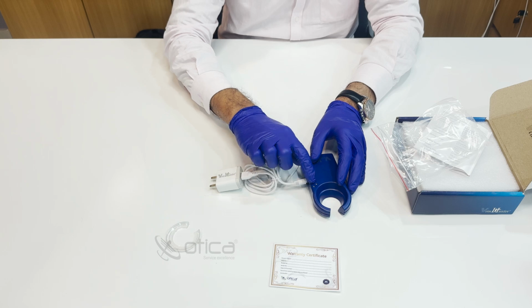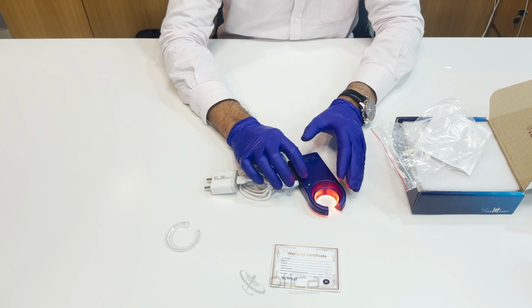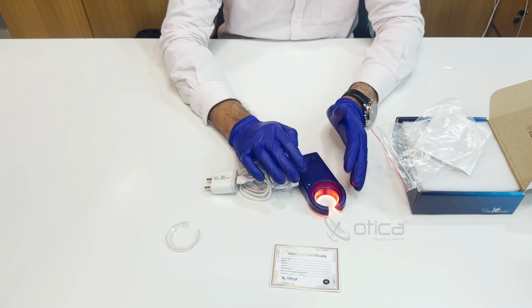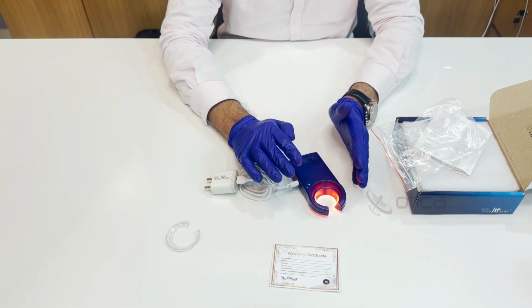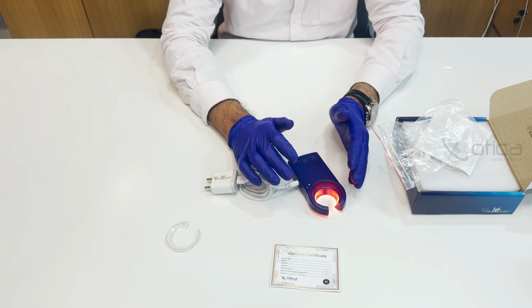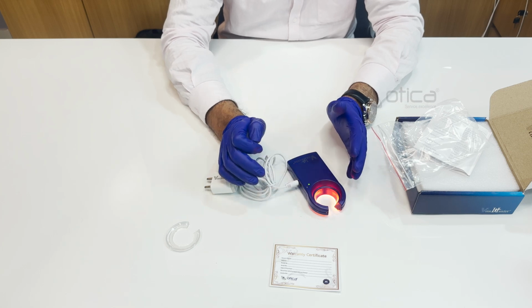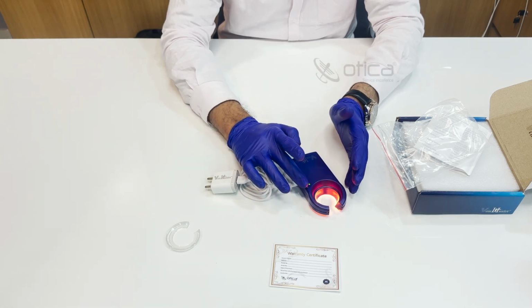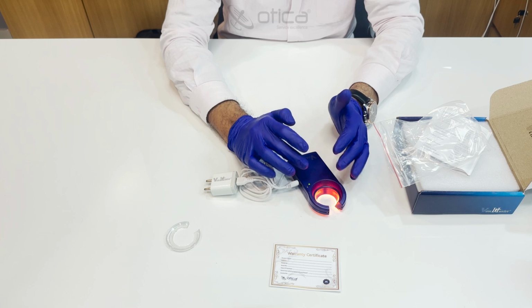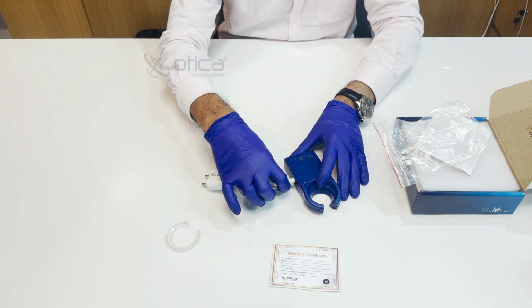The company has given two different indicators. The lower indicator is the battery status indicator. Green means the battery has sufficient charge. Slowly the battery will drain after many uses, and this LED will turn red, which means you need to charge the device. The upper LED is the charging indicator. When you put the device on charge, it will show red, and after the device has fully charged, it will turn green, which means your device is fully charged. So this is how the charging works.